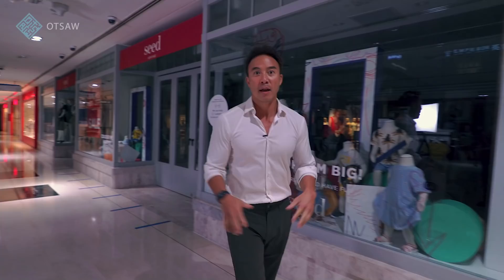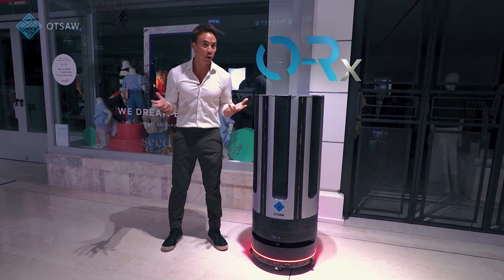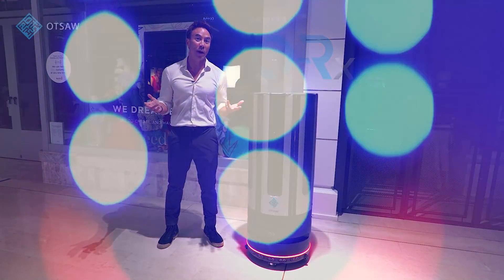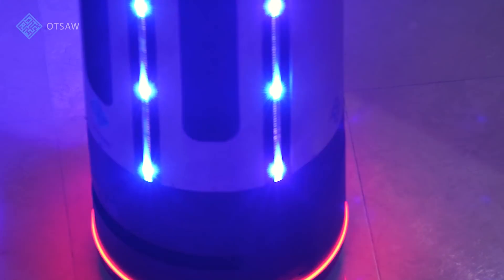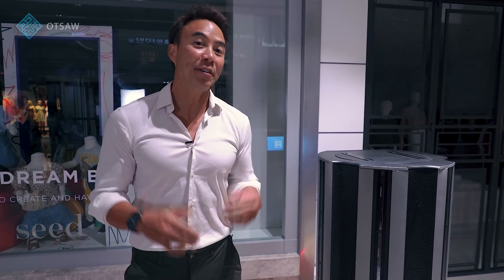The world is at war against an enemy that we cannot see, we cannot touch. That of course is COVID-19. But now we have the solution right here with the ORX, the world's first autonomous disinfection robot that uses UVC LED light to kill and eliminate COVID-19. But I'm sure you're wondering how effective is the ORX and how does it eliminate and disinfect against the coronavirus? Let's find out right now.